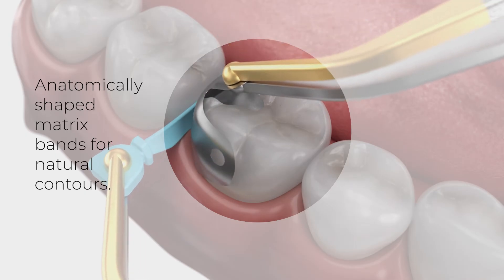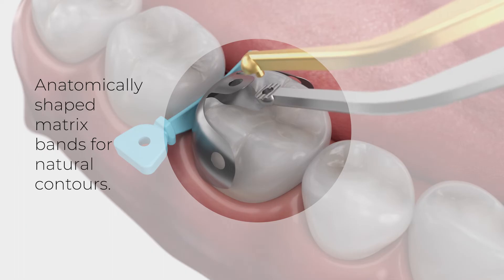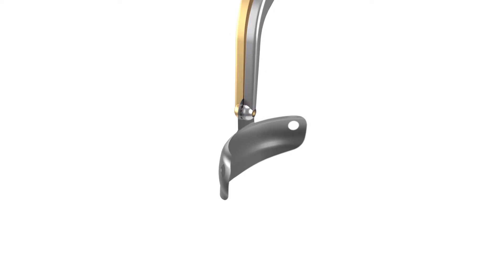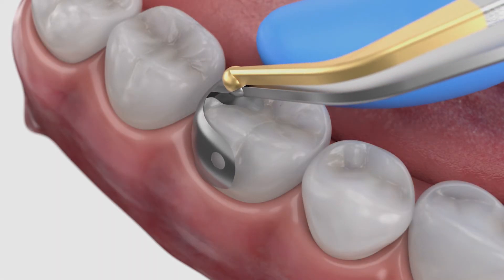After removal of the metal shield, insert the Paladin V3 matrix between the wedge and the cavity prep. Alternatively, if you choose to cut the prep without using a Wedge Guard, you can begin with the placement of the Paladin V3 matrix band.